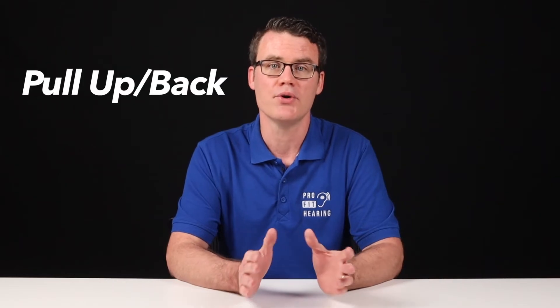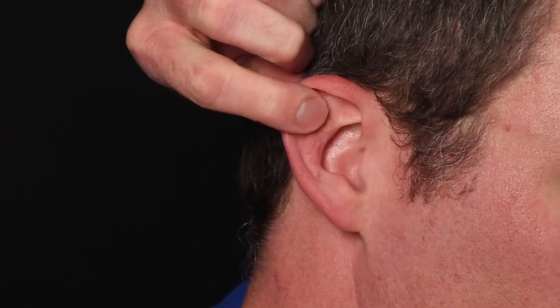Step 2: Pull up and back on your ear with the opposite hand. This helps straighten out the ear canal for easier earplug insertion.